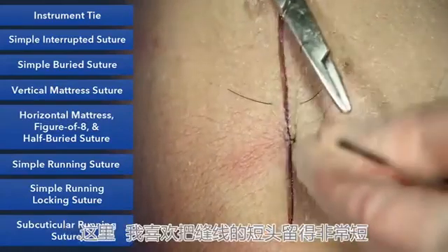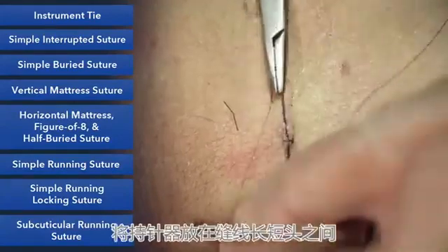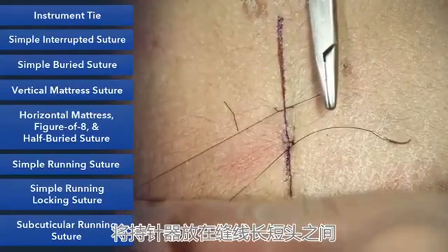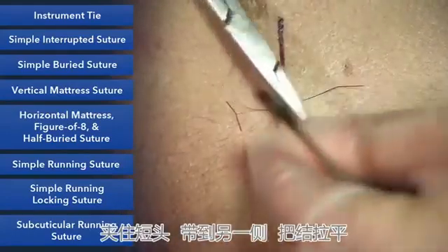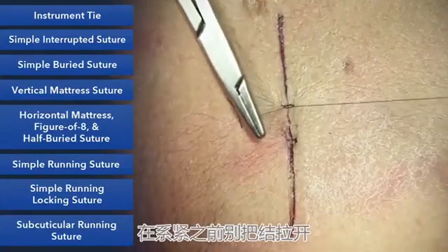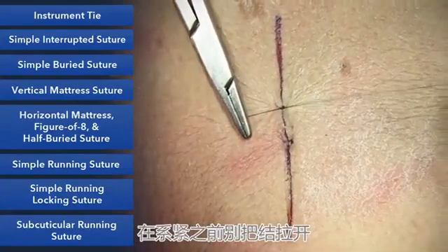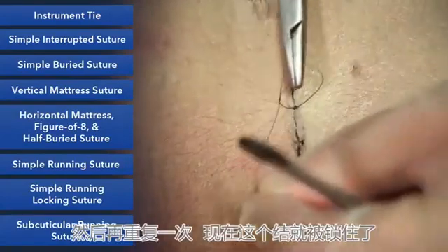Notice I like to keep the short end very short. Your instrument doesn't move around very much then. Keep the needle driver between the two, grab the small end, pull it to the opposite side, squaring your knot, lock it down with that surgeon's knot. Don't pull up on it now until you now grab this end and pull it through for the second time, and now it locks down.